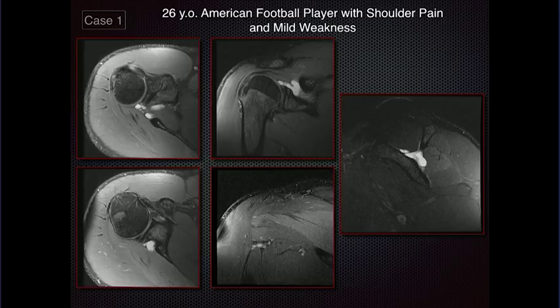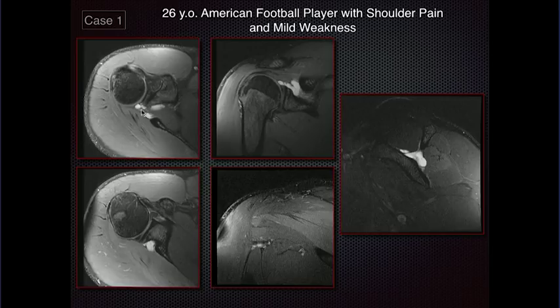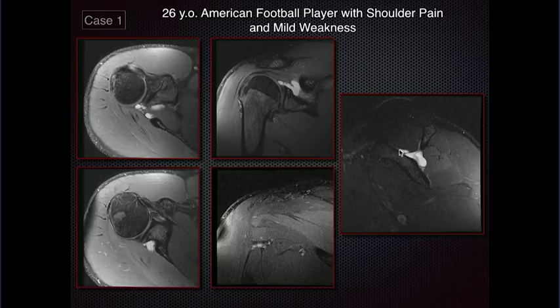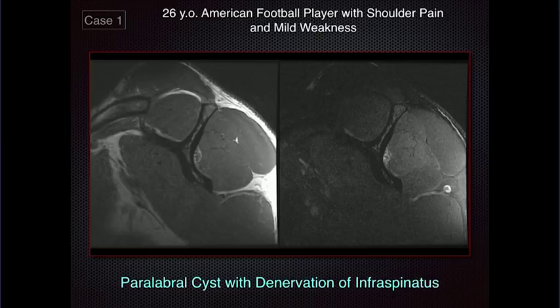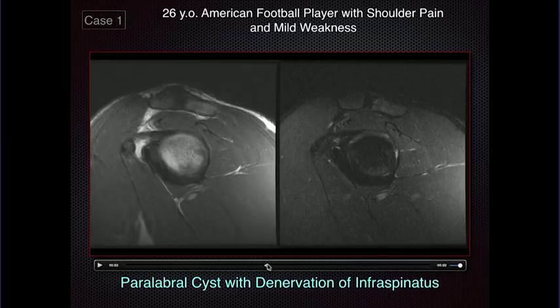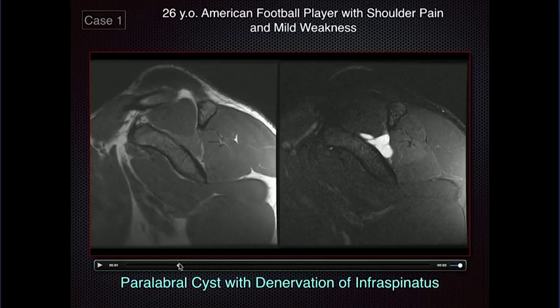Here's a football player who had shoulder pain and mild weakness. We could see a multilobular cystic structure along the glenoid — a paralabral cyst sitting in the spinoglenoid notch of the scapula. You can see mild hyperintensity occurring in the infraspinatus muscle — some denervation change because this cyst is pushing on the branch of the suprascapular nerve that goes to the infraspinatus. As I scroll through, you can see the cyst along that spinoglenoid notch and the hyperintensity in the infraspinatus muscle.